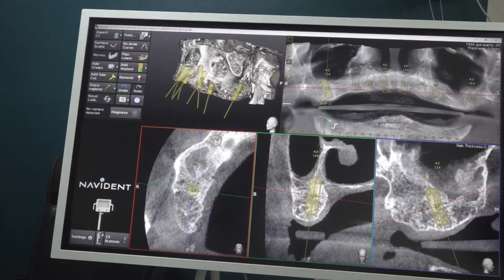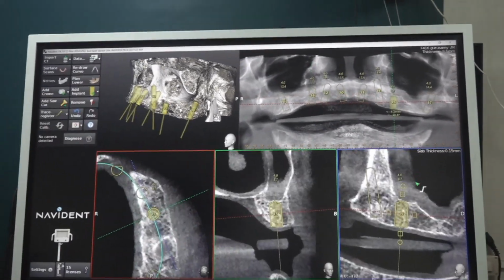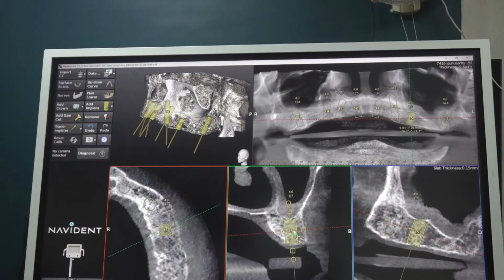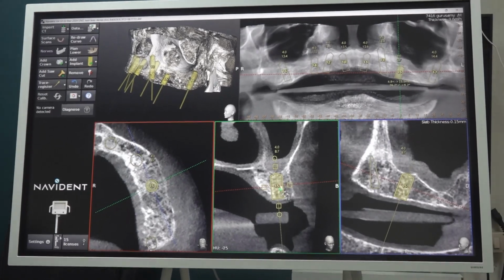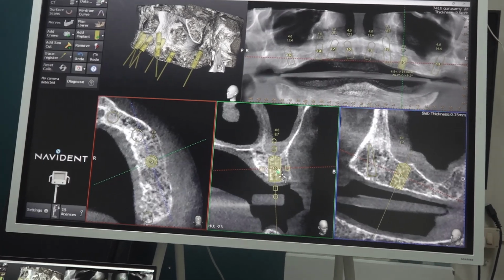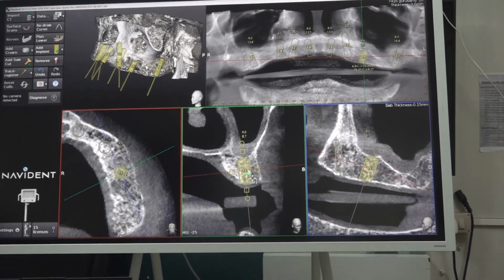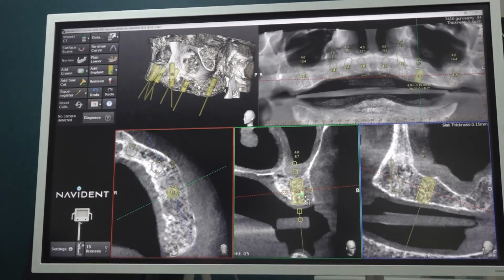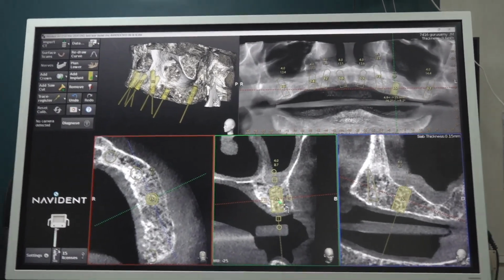In Misch's book I read, sir, they say that even if it is in cantilever, we should follow a principle of anterior posterior spread, AP spread. Yes. Many times we violate this AP spread. Since you are using titanium bar, you have more freedom. There, the metal used is different, chrome cobalt. But titanium has different properties than chrome cobalt. Due to its flexibility. One thing is, its weight is very much less.